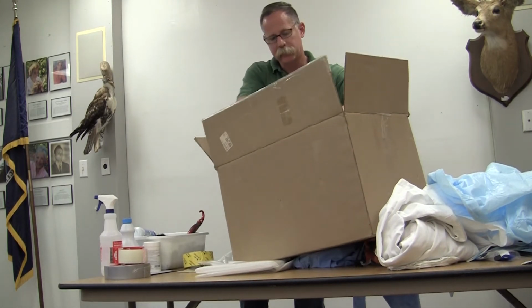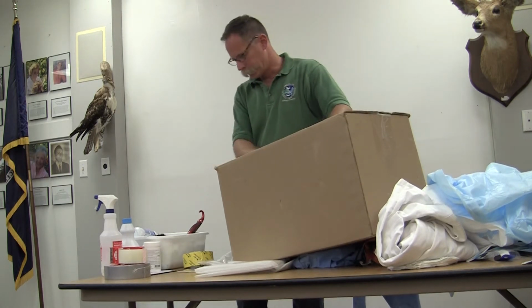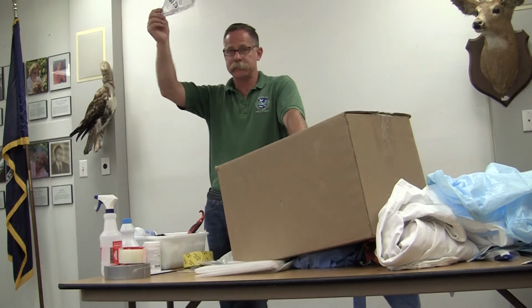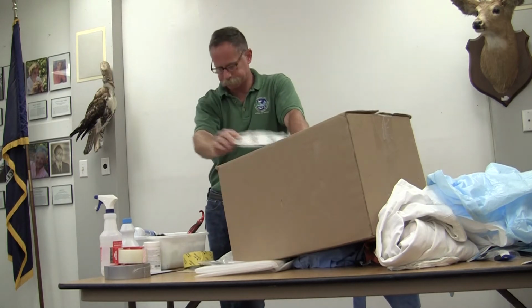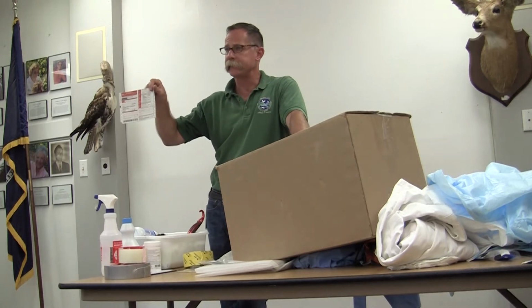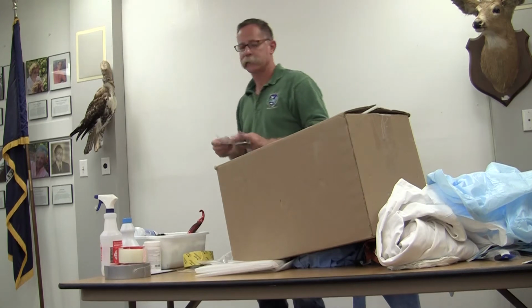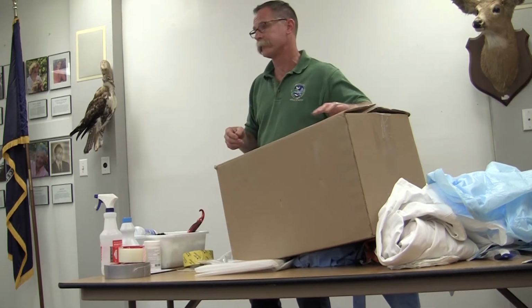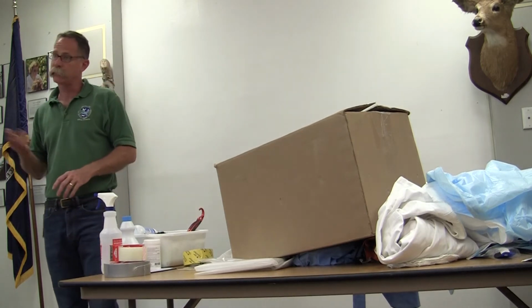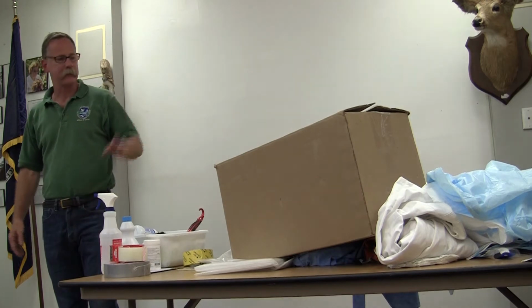And then you seal the cooler up with a little packing tape. Seal the cooler up, you put a UN 3373 biological specimen sticker on there, and then you fill out your UPS form depending on what system you have in your office, and then you call UPS for a pickup. In most places in New York, UPS ground will get to us the next day, so just use UPS ground. Don't ship on Friday because we don't work on Saturday, so it would just sit wherever over the weekend.